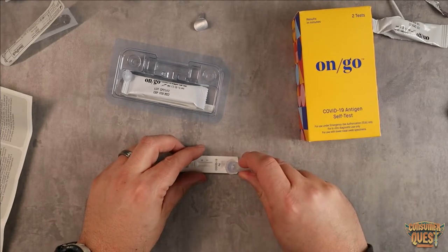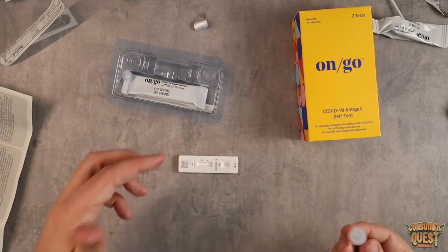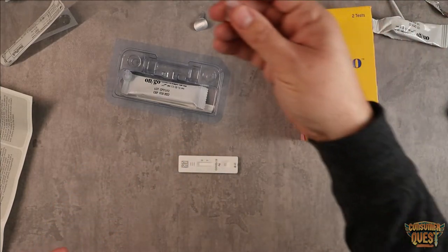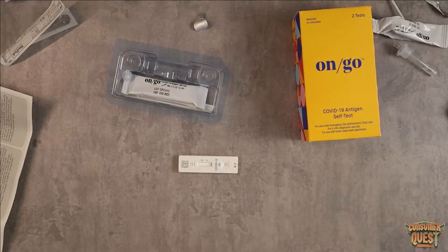We're going to tip it over and squeeze out one, two, three drops — just like that. Now we can wait, and we can discard the remaining fluid. The rest of the fluid is not necessary.